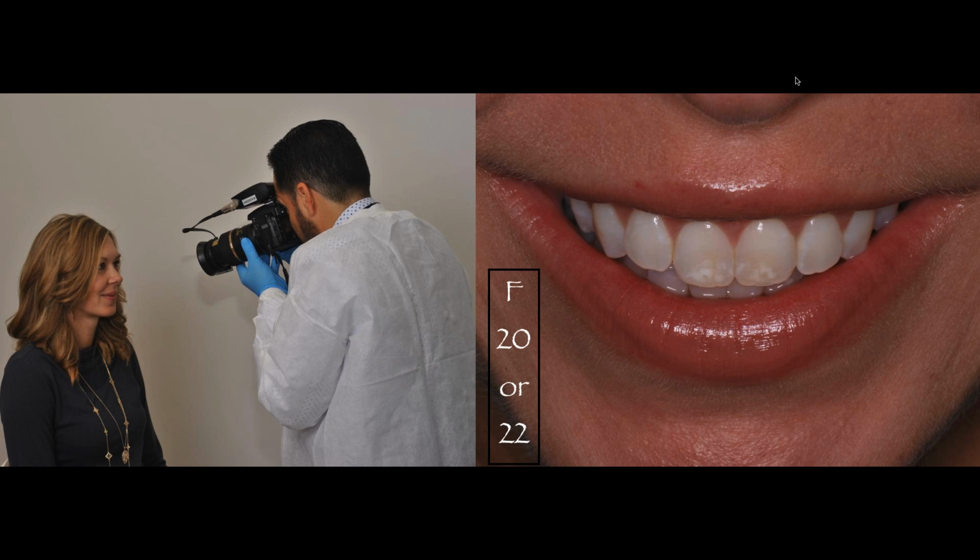Now you can see that for this photo, I'm not looking straight ahead to my patient. The lens of the camera is slightly angulated, going from the top to the bottom, so that I can capture that photo coming from the top to the bottom.